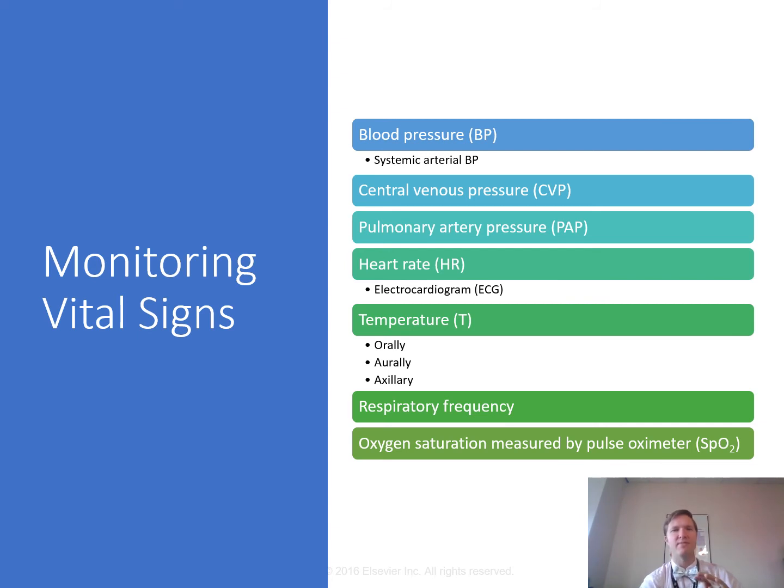The heart rate alarm may simply indicate that the electrodes have been disconnected from the patient, or it could even signal a more critical event, like the patient has become disconnected from the ventilator, or they have severe hypoxemia or hypercapnia, right, all that good stuff. There are other factors that can affect heart rate. That includes pathological changes to the myocardium, so if they have an infarction, hypoxemia, and they're throwing PVCs. Also drug reactions to medications, especially medications that speed up or change blood pressure, slow down, decrease blood pressure, right? They could also be a response to anxiety, pain, and stress.